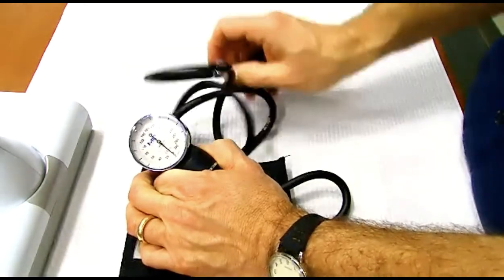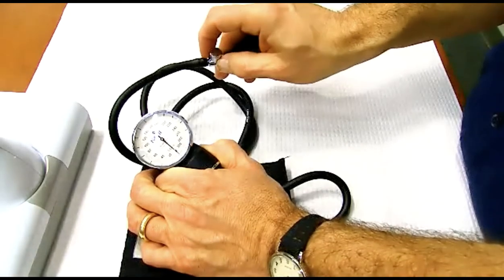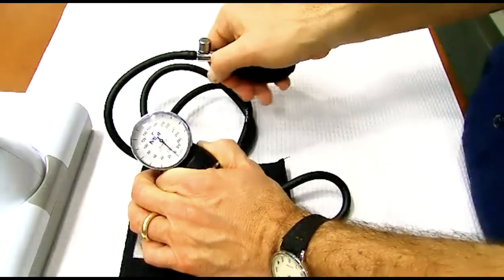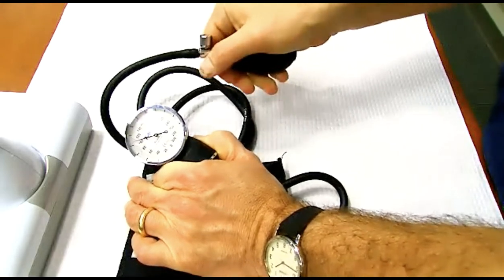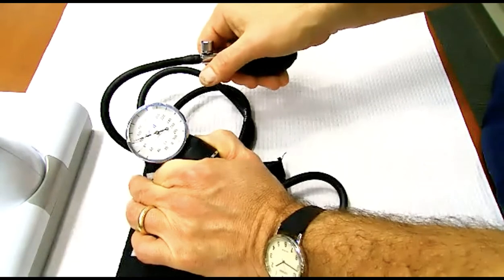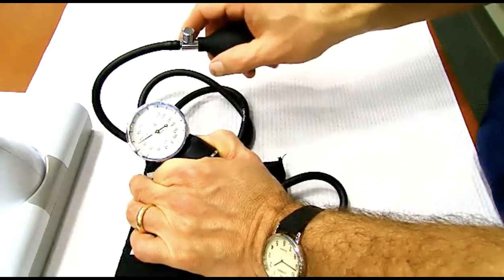Let's take it and turn our bulb valve. My hose is in the way there. I'm going to turn this all the way to the right so it's closed off, and I'm going to start squeezing. So you see the pressure gauge is going up there. And again, you have to kind of lean on it to keep the pressure up a little bit, but I've got some pressure in there. You'll notice it's staying there for the most part.